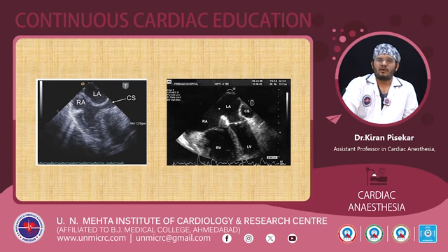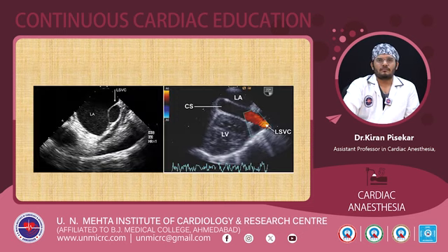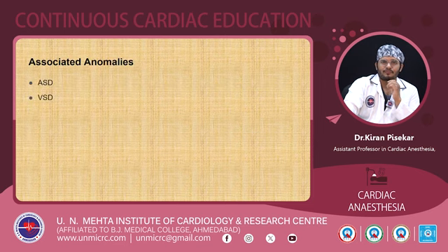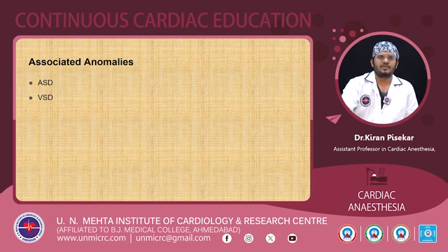Again, if you pull the probe a little bit from the 4-chamber view, we can see the coronary sinus as well as the left SVC. As I told, this is the LA and this is the SVC. Here in the mid-esophageal view at around 80 degrees, we can see the LSVC draining into the coronary sinus. We can see the flow of the coronary sinus, LSVC. Associated anomalies with this are ASD and VSD.